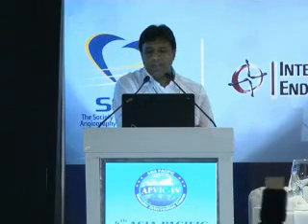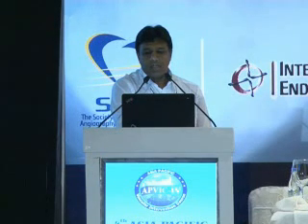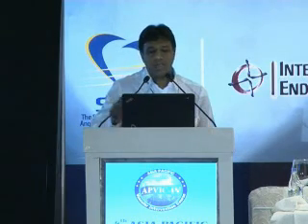They have a hemostatic valve that prevents blood reflux and air embolism. Furthermore, they protect the vessel entry point from intimal injury and should be used whenever multiple guide wire exchanges are anticipated. Sizing of the sheath is based on its internal diameter. A 7 French sheath will accept up to a 7 French catheter. In addition, the side port of the sheath can be used to inject contrast or measure arterial pressure.